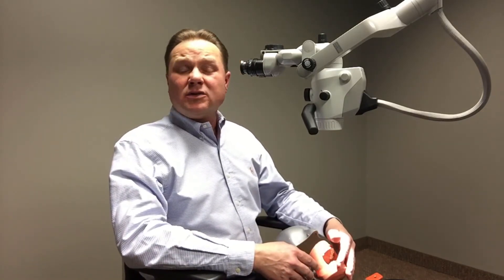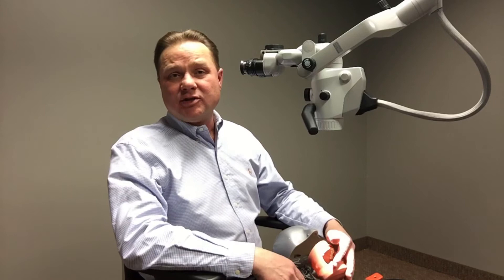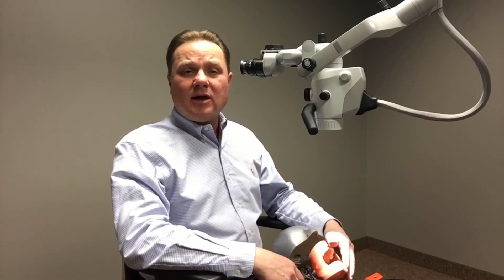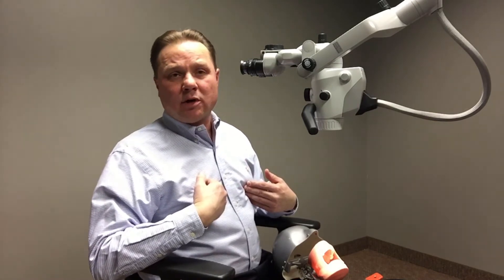There are going to be many cases where the patient is going to have to be moved into various different positions. And I want to detail how Zeiss and Xtero can help maintain those good ergonomic principles for you without having to contort our body.